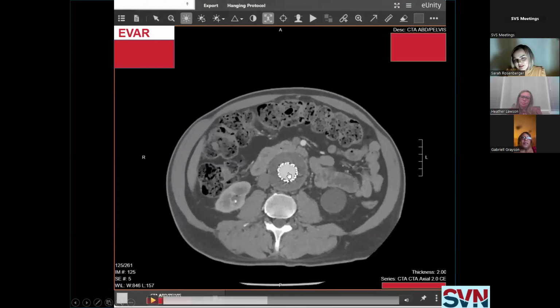So I like to pause here to say, here you can see where the contrast and the iodine is in perfusion, and so the blood that is in circulation is lit up. But here where the aortic sac remains and is depressurized, the blood that was in that sac at the time when the stent was deployed got trapped in there.